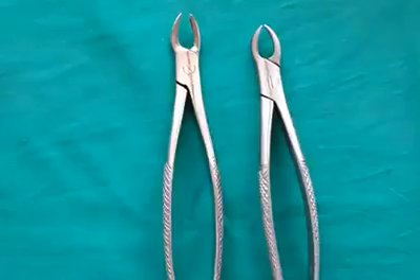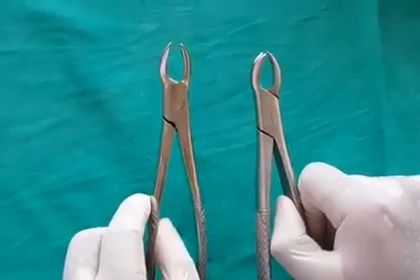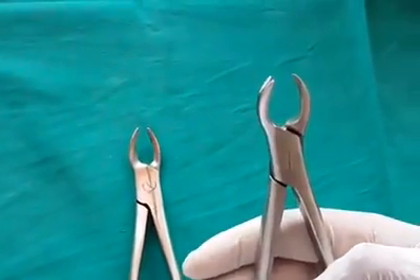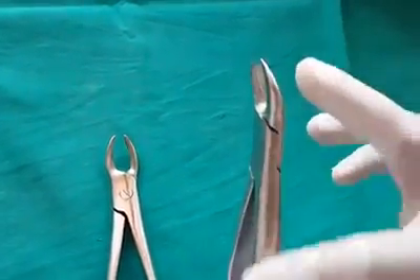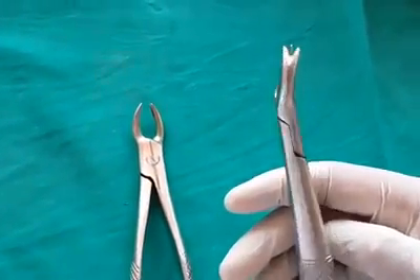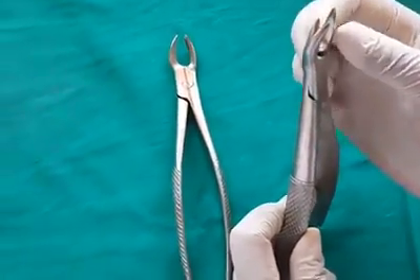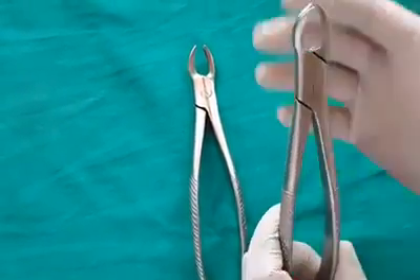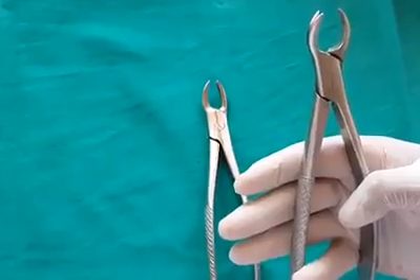Maxillary cowhorn forceps are used for maxillary molars and is a paired instrument, one for left and one for right side. It is especially used for extraction of grossly decayed teeth which cannot be gripped by maxillary molar forceps. There is a single conical beak which engages the buccal furcation area, determining the side. The other beak has two prongs which engage the palatal root.